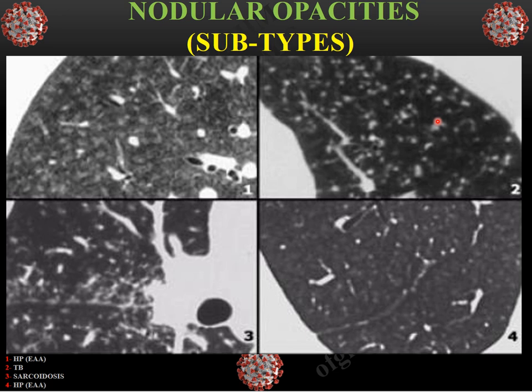It can also be miliary metastasis for the differential diagnosis. However, these nodules are accumulated near the bronchovascular airways, in peribronchovascular and perilymphatic distributions, which is called the perilymphatic nodules. The most common causes for this are lymphangitic carcinomatosis or sarcoidosis, as in this case of sarcoidosis, because it is also associated with lymphadenopathy.